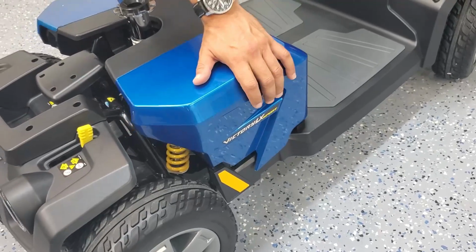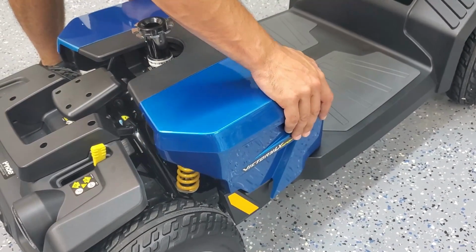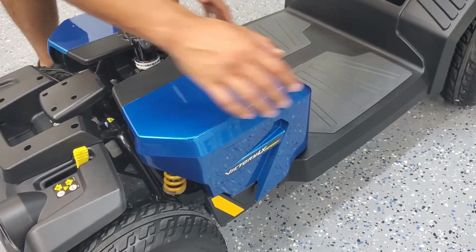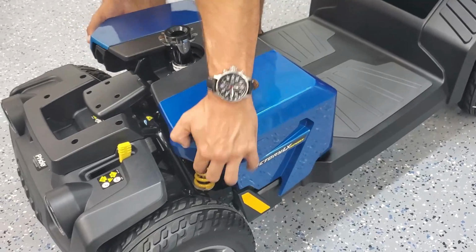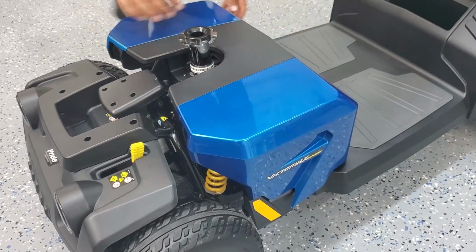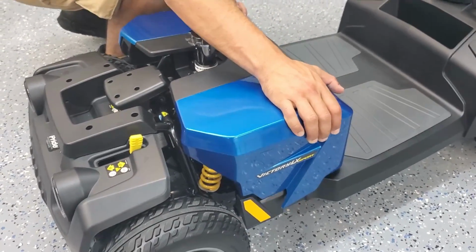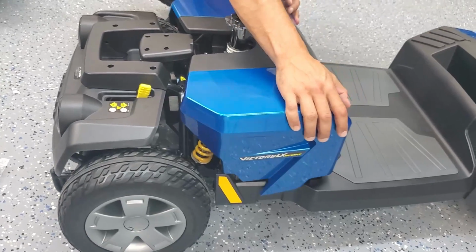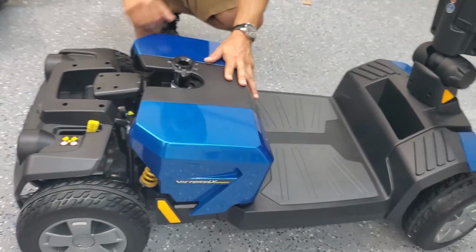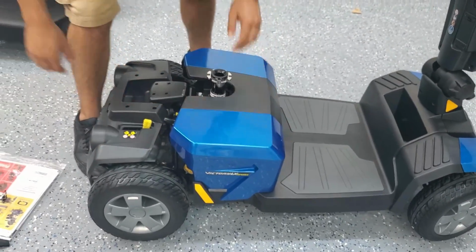Now, the shroud cover sometimes is a little difficult to get to fall into where it's supposed to perfectly the first time. Don't get frustrated. Find those tension points on the outside, and eventually you should hear the unit clip where it's supposed to go into place. Now, if you look at the front, there are two slots, which I like to line up, and then the rest of it falls into place.